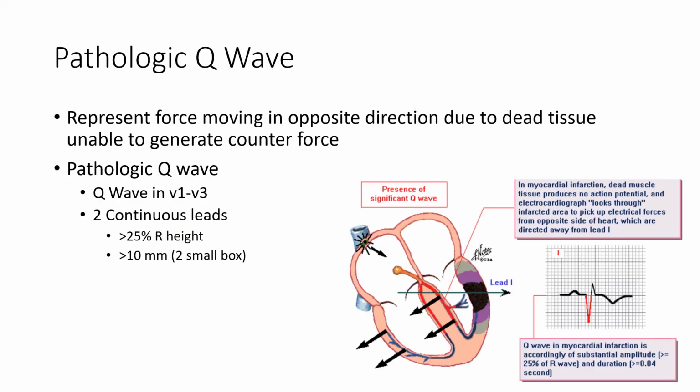in that ECG. Here's a great example of a pathologic Q wave in lead 1. Normally, the left side of the heart would be larger, and the overall net force would either be equal when you consider the right side of the heart depolarizing at the same time, or it would actually probably be moving towards lead 1. But in this case, we have an area of necrosis producing no force. So lead 1 detects only the depolarizing force of the right atria or the septum moving left to right. And thus, we get a downward deflection and then finally come back up for our QRS.